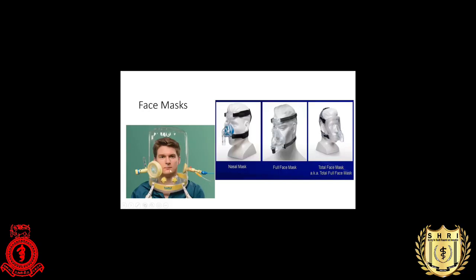The main advantage of the helmet is that it prevents environmental contamination in COVID patients, and it also prevents aspiration if the patient has active emesis. This is the one we usually use in Sri Lanka, and you have to select the ideal size for the patient when you fix this on the patient's face. It should cover the bridge of the nose and the lower part of the mouth. It should not be jutting out from the chin.